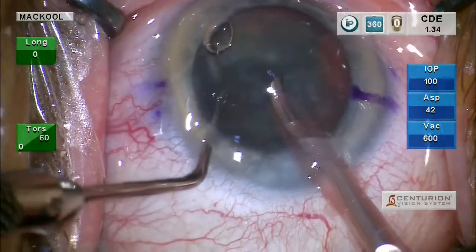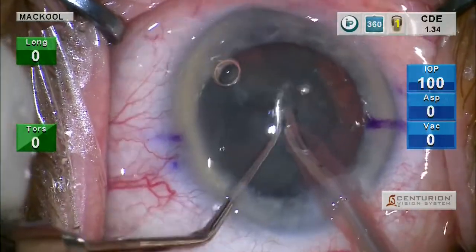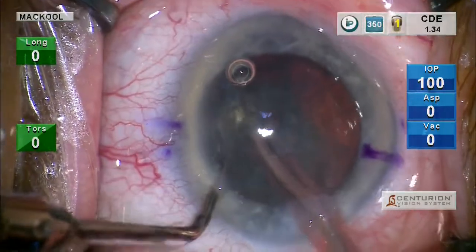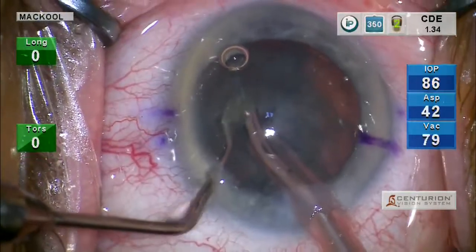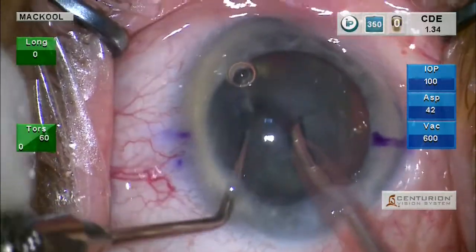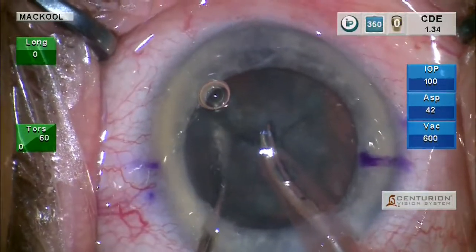Because the better job I can do removing them without bringing them very far forward, and getting them near the endothelium, the happier the endothelium is.